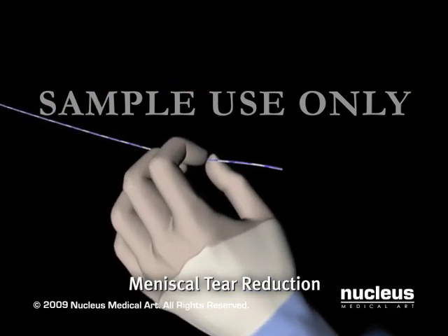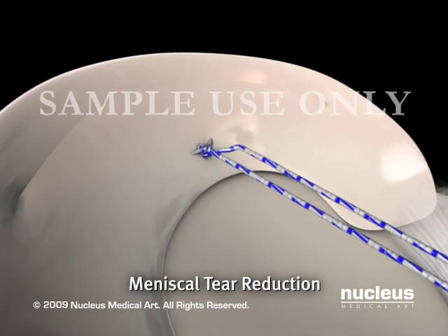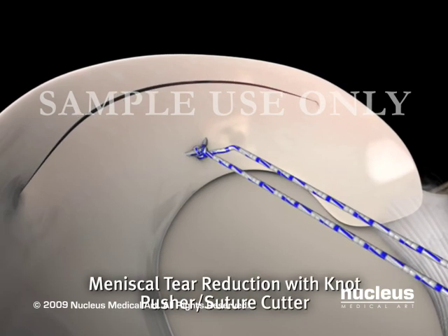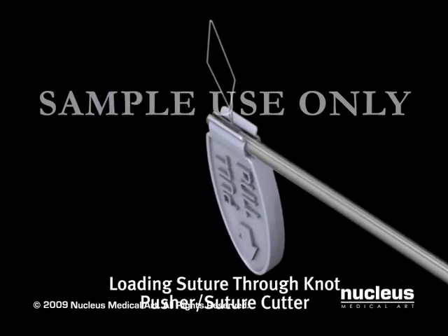The post end of the suture is pulled, advancing the sliding knot, which reduces the meniscal tear. If the initial reduction of the meniscal tear is not satisfactory, the CrossFix knot pusher suture cutter is used to further reduce the tear.